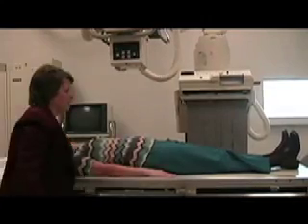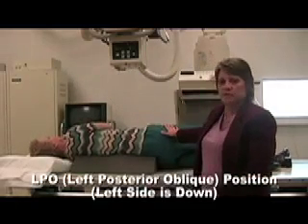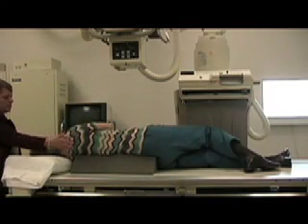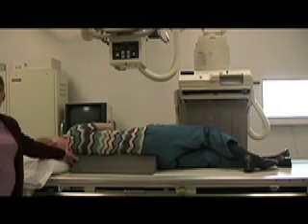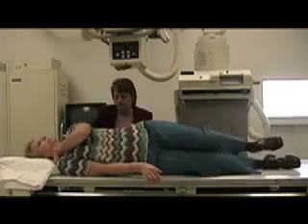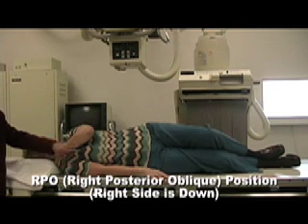Now we're going to have you turn up away from me a little bit. This is LPO position — her left posterior is touching the table and the right is up, so there is a left posterior oblique. And we'll turn the opposite direction — if we raise the left side up, this is an RPO position, right posterior oblique. The right posterior is touching the table.